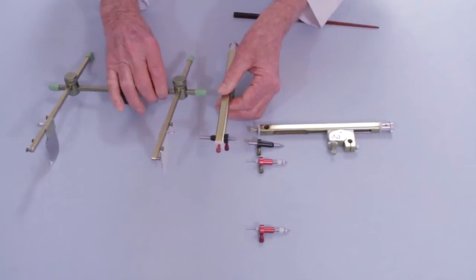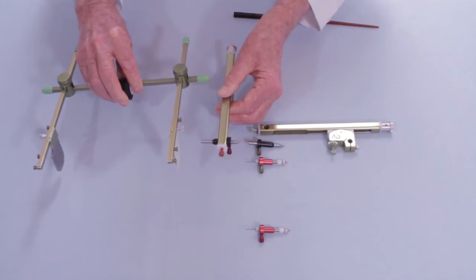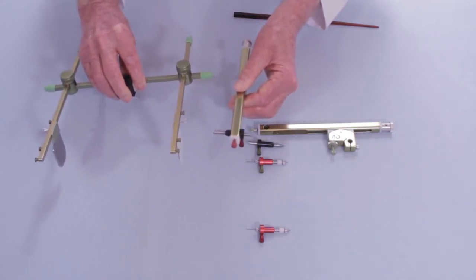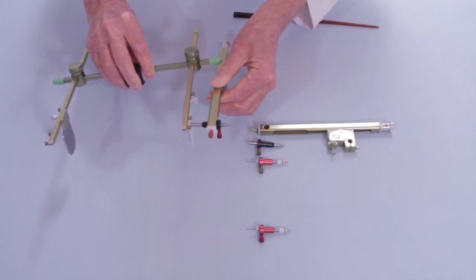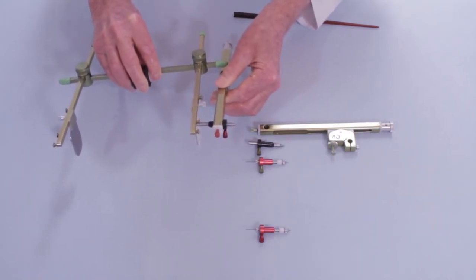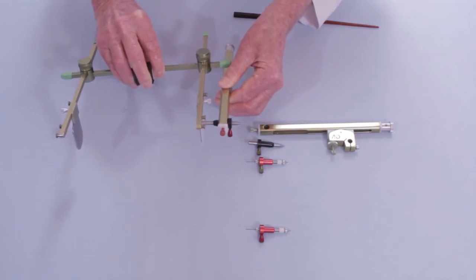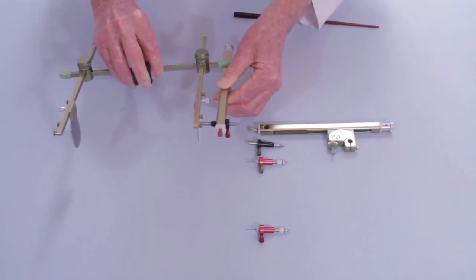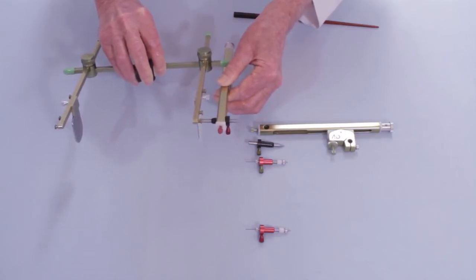Okay, I want to show you now what we've accomplished in doing that. If this flag assembly were on the patient and the sidearm, we would move the sidearm in until the flat part touched the flag assembly, and we would then lock that sidearm on our crossbar so that that distance has been established from the sidearm to the flag assembly. Once it's locked there, then we would reverse it and put the point toward the flag.